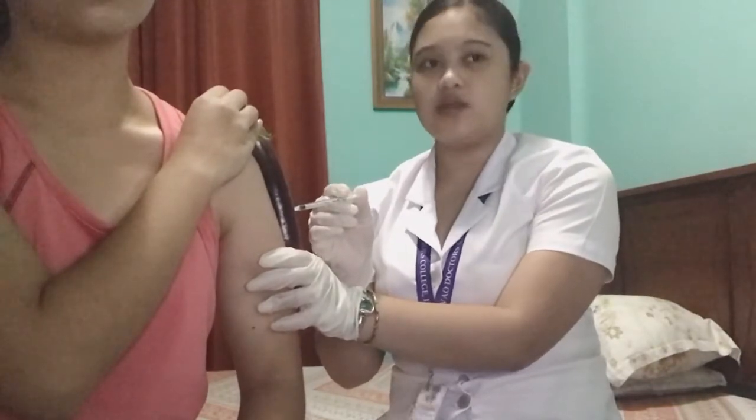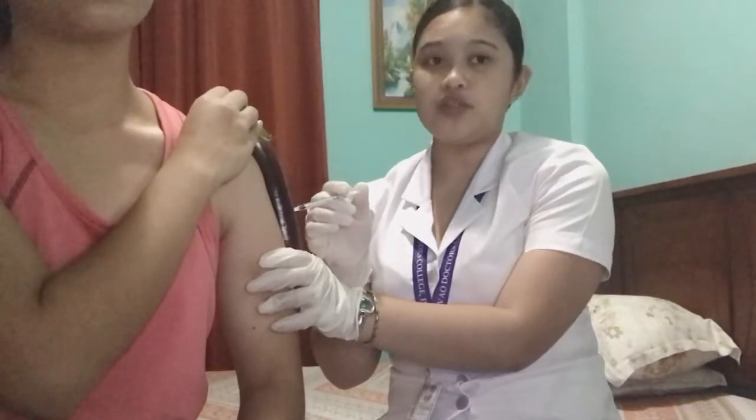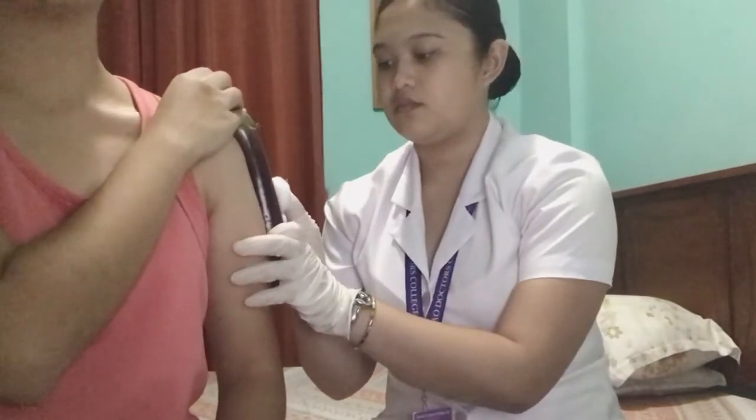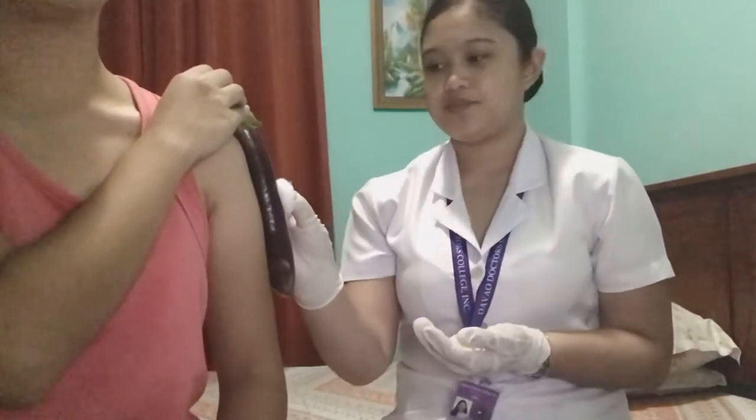Then quickly withdraw the needle and place a gauze swab on the site, applying pressure on it gently, but don't massage the area. Document the procedure, then record the time and the amount of drug on the medication sheet.